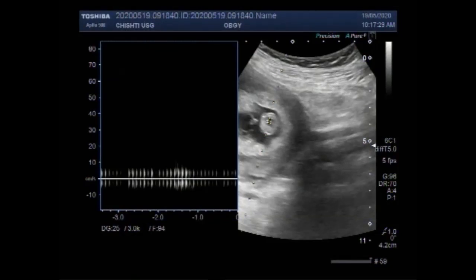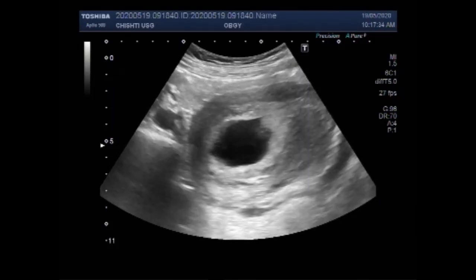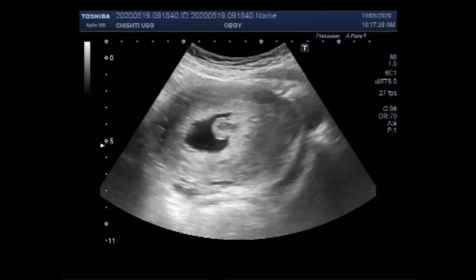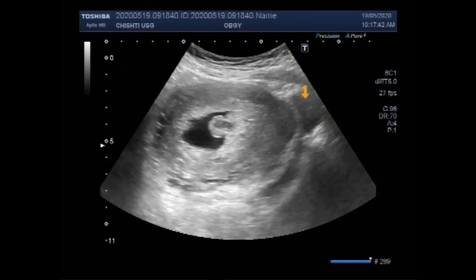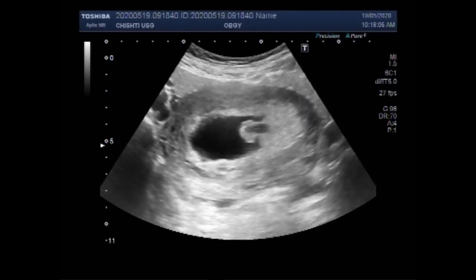Dear viewers, I hope you are all fine. This ultrasound video shows a case of missed abortion, also called missed miscarriage. A missed abortion is a miscarriage in which the fetus did not form or fetal demise had occurred, but the placenta and embryonic tissues are still in the uterus. It is also sometimes called a silent miscarriage. A missed abortion is not an elective abortion.